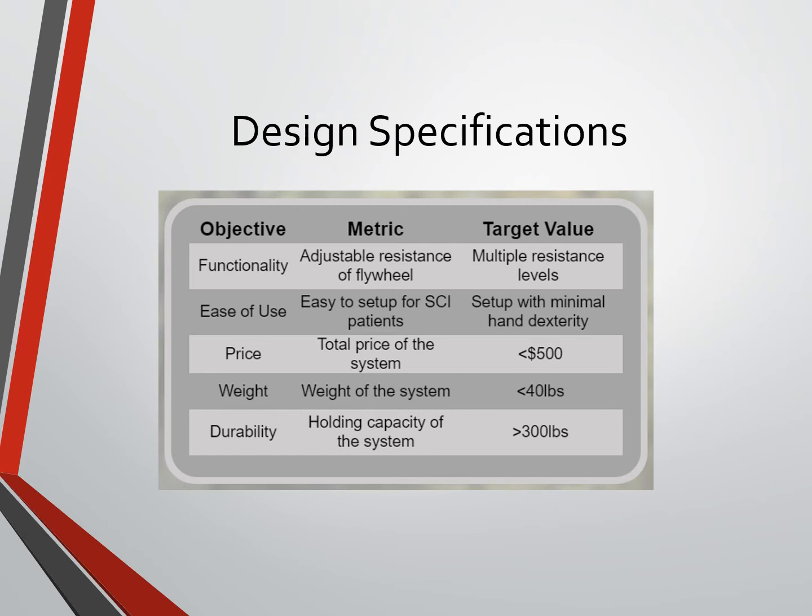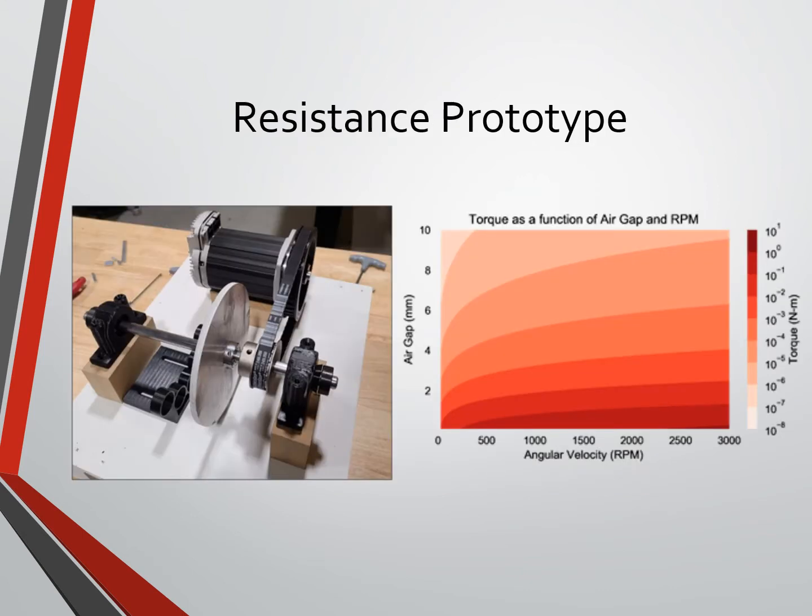We also incorporated pre-programmed courses as well as an SD card system to allow users to make their own courses if they wanted. We spent much of the first semester doing research and making initial designs in CAD to find the best ways to make our trainer.